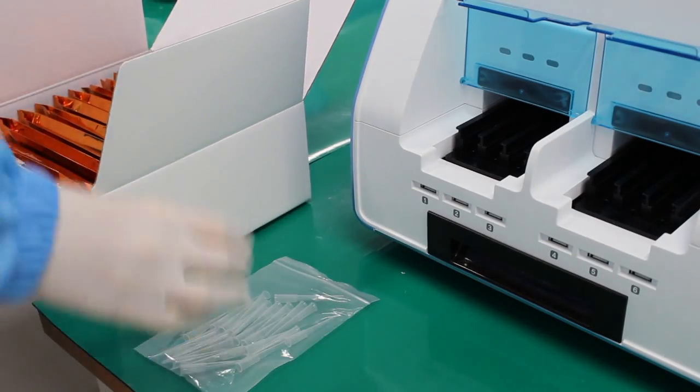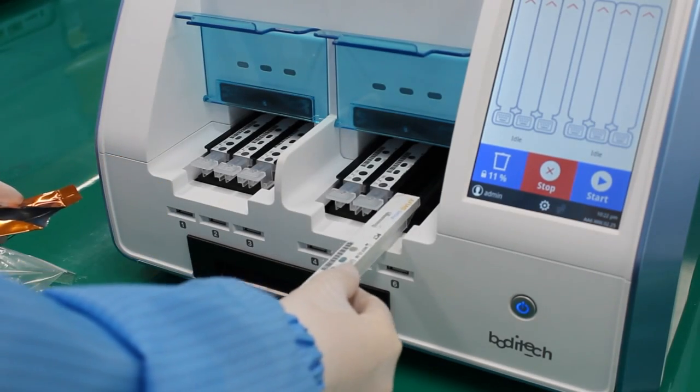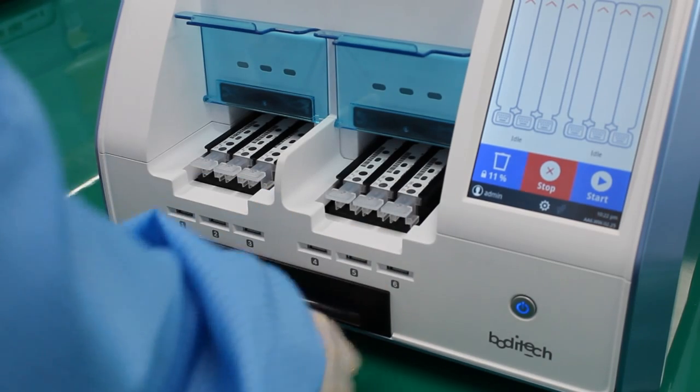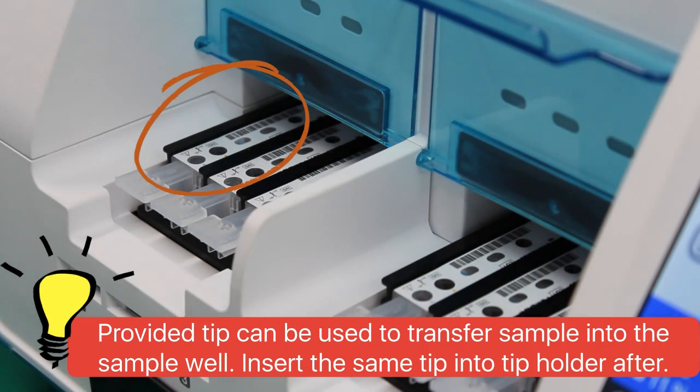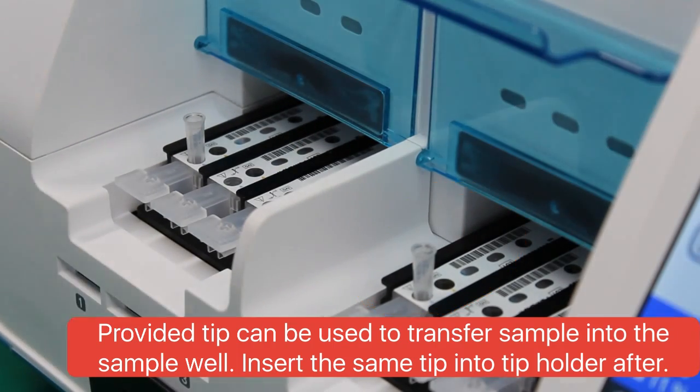Insert 6 cartridges of the same PCT lot number you want to calibrate in all channels. Dispense level 1 calibrator in channels 1 and 4, and level 2 calibrator in channels 2 and 5.